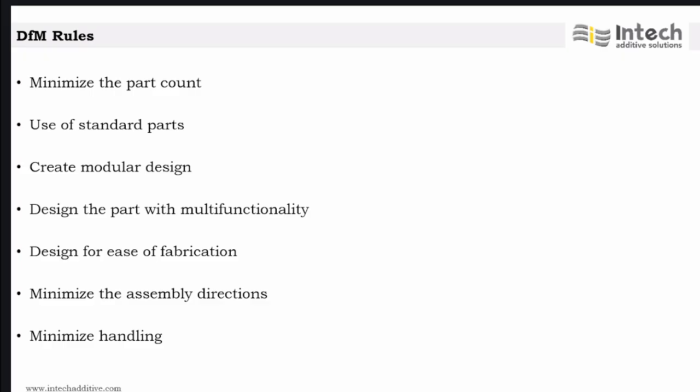That's why the cost is low when you go in for standard parts. When you can customize the geometry, then you can do it, but you don't have to redesign standard parts if they already exist. So we need to think about which part to customize and which not to.